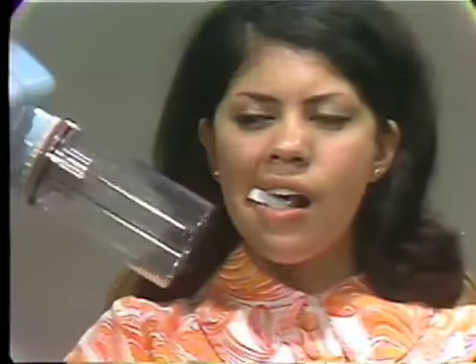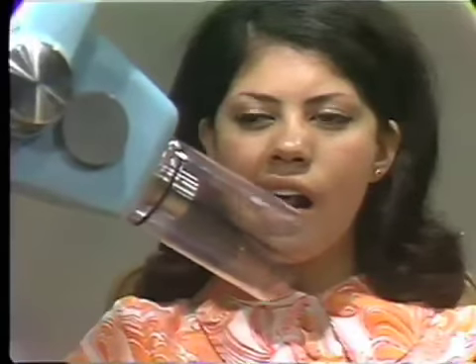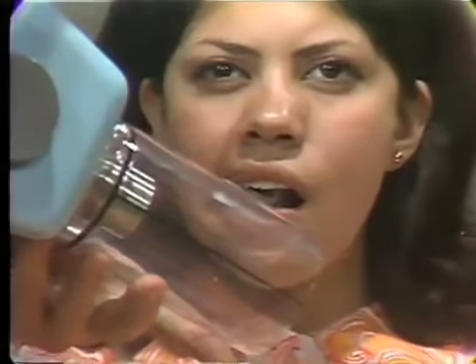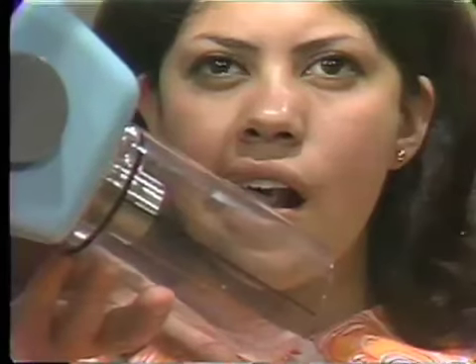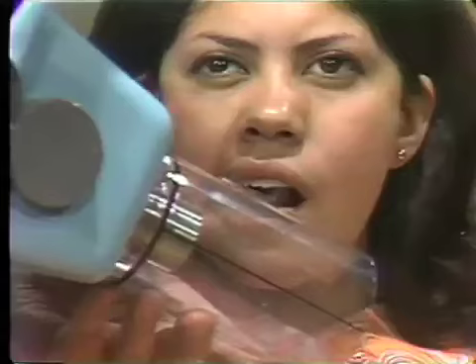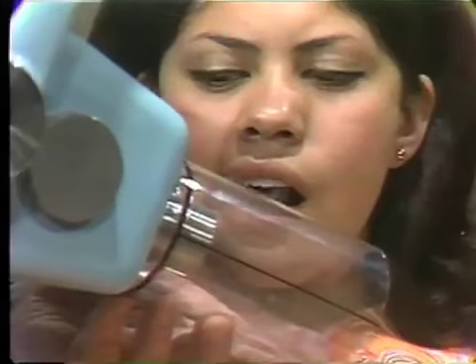Next, we want to determine the vertical angulation. So we bring the X-ray machine into play between our eye, the observer's eye, and the bite block, and I adjust the angulation so that we see a uniform strip of bite block showing above the top of the cone.